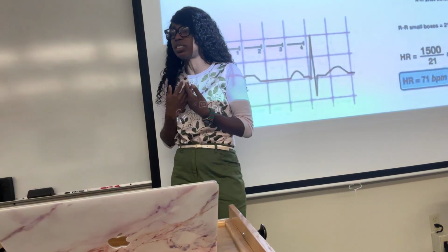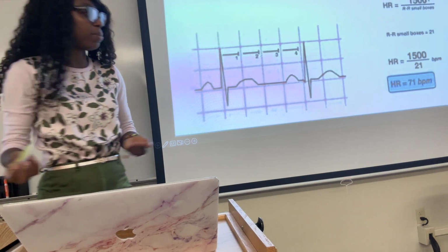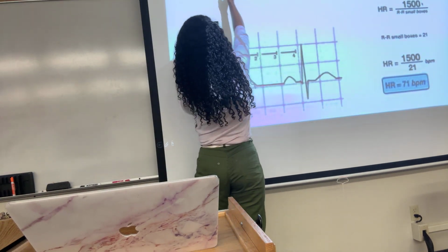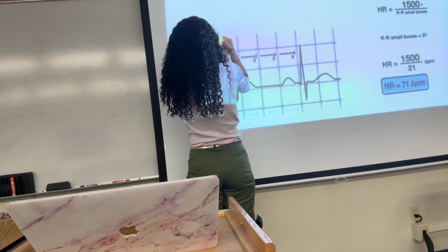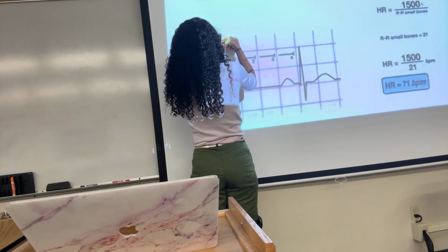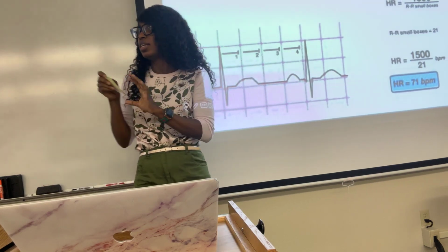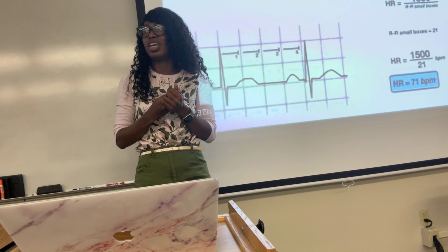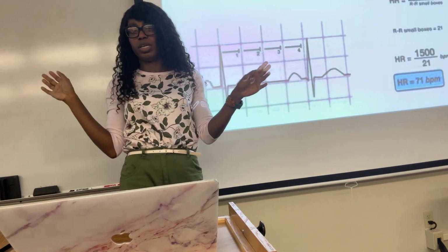If you're not able to tell, I would get a sheet of paper and literally put the paper next to it and then mark. Okay, it ends here, so I mark. And then I use the edge and I see, oh, same place, it ends. So that way it tells me, do you guys get that? Just to see if it's measured equally. Because sometimes your eyes might not be able to give it to you, but most times it's really obvious, okay?